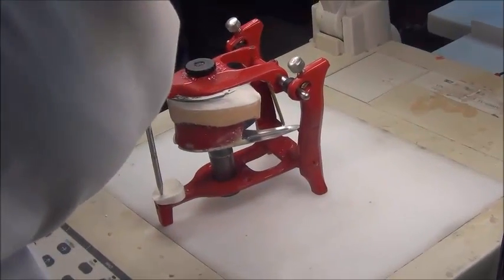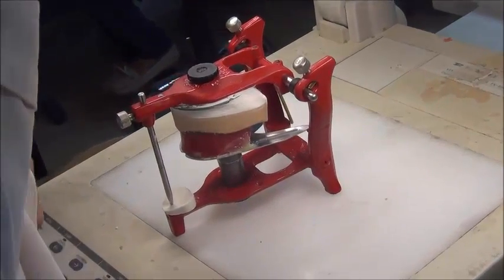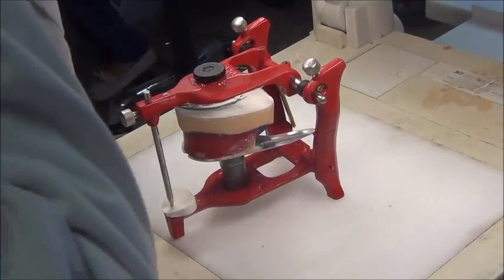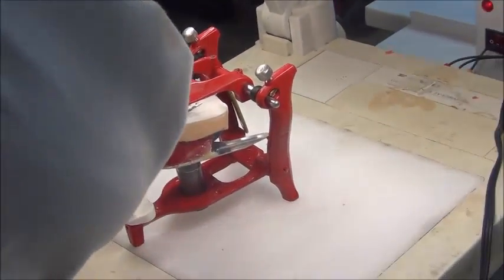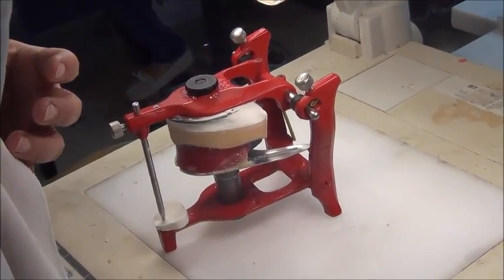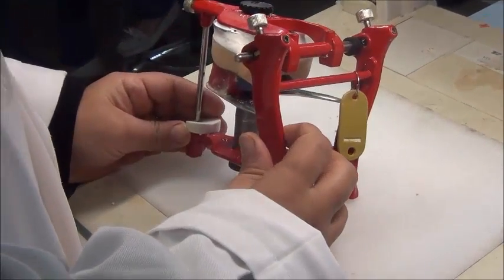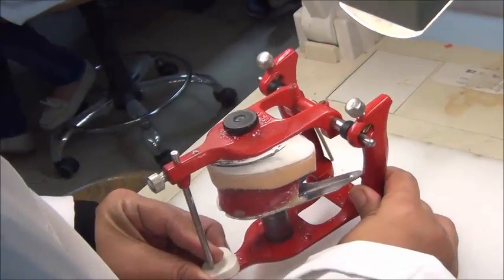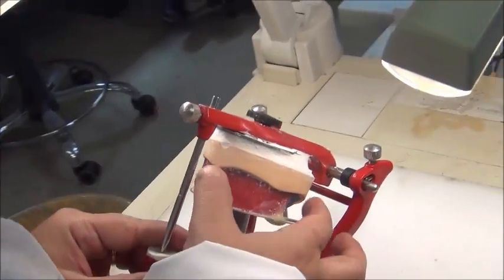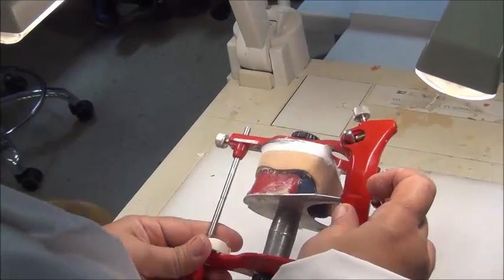To ensure that the upper is correct, we're going to give you some guidelines on how to judge your arbitrary mounting. We are using arbitrary mounting, meaning that we are using only a mounting jig. We are using the wax rims made to the average values that we have given you, and we're going to mount according to an average value articulator, the articulators that you have. If I look closely at my mounting, I'm looking at an articulator with casts attached to it. So I'm going to talk about this attachment.